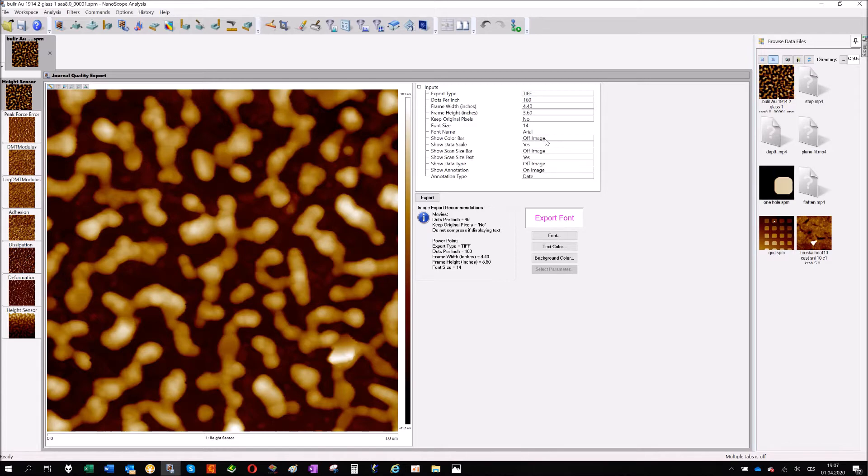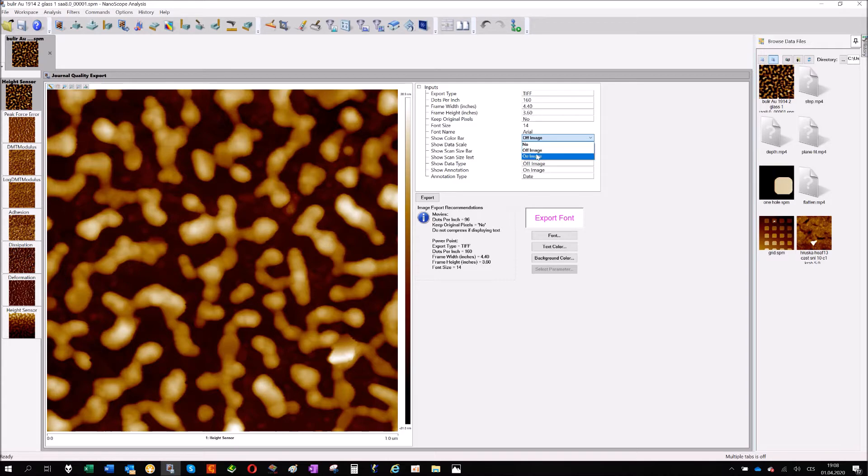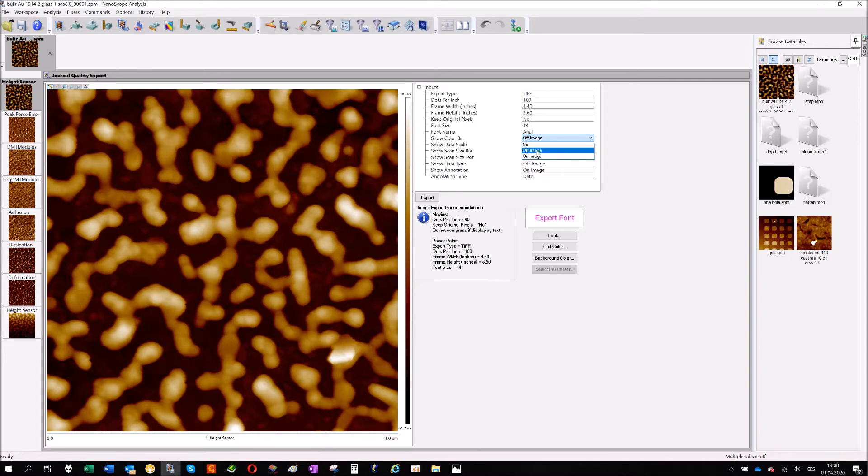Actually it's not only yes or no. It's no if you don't want any, and two options for yes. On image means the information will be on the image itself. Off the image means the information will be next to the image.